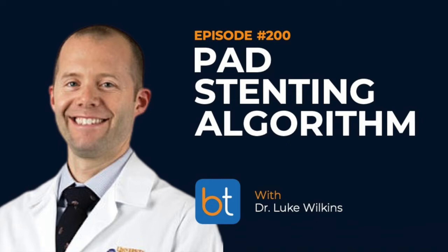So back to the algorithm, let's walk through it together. First, it looks like you have to decide the TASC classification of the lesions. By the way, for our listeners, we're also going to include a link to the TASC guidelines for reference. So the first step is to decide if it's a TASC C or D lesion, and at that point, you consider a discussion of bypass.